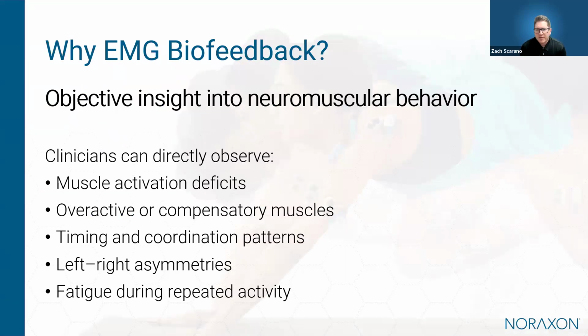So, EMG biofeedback gives clinicians something that's difficult to obtain through just observation alone. It allows us to directly visualize muscle activation and not just whether a patient can perform a movement, but shows how the neuromuscular system is coordinating that movement. And so this can reveal things like underactive muscles, compensatory activation patterns, timing differences, or even fatigue during repeated tasks. And because of that, EMG biofeedback has become an important tool in many areas of rehabilitation.